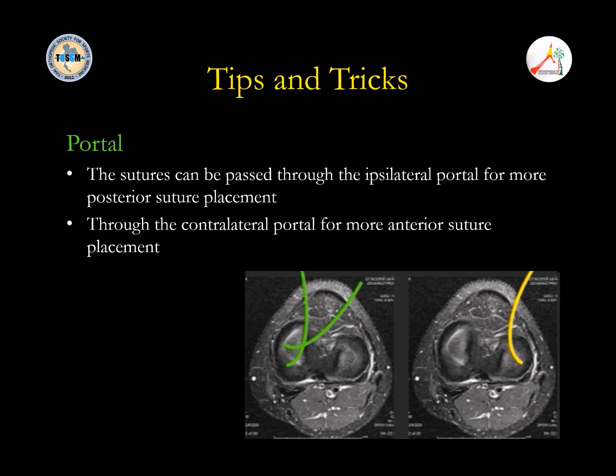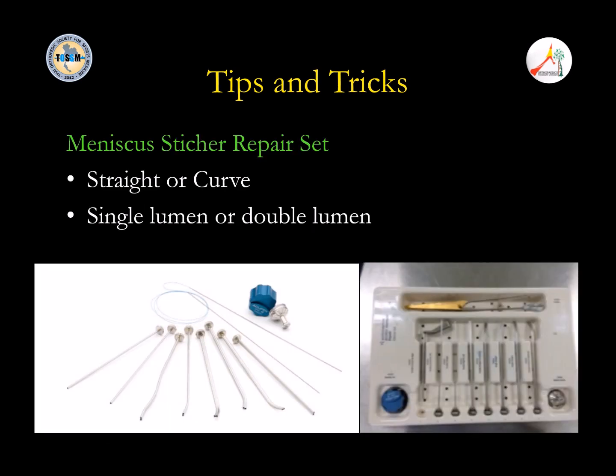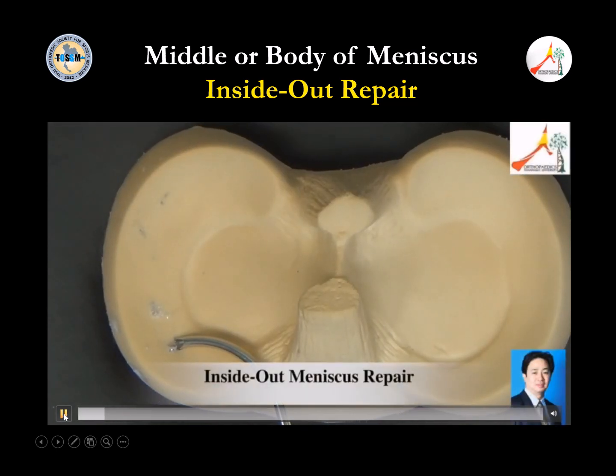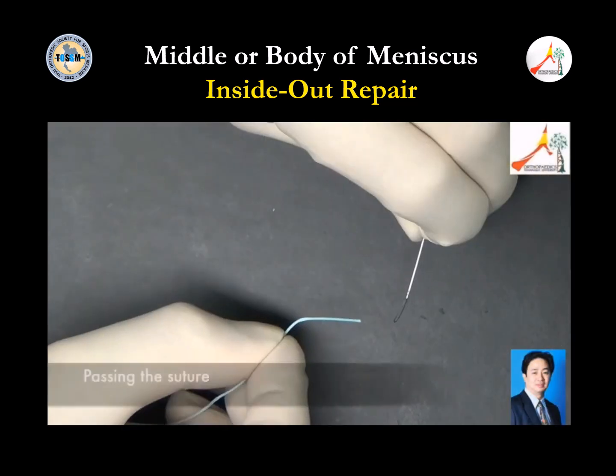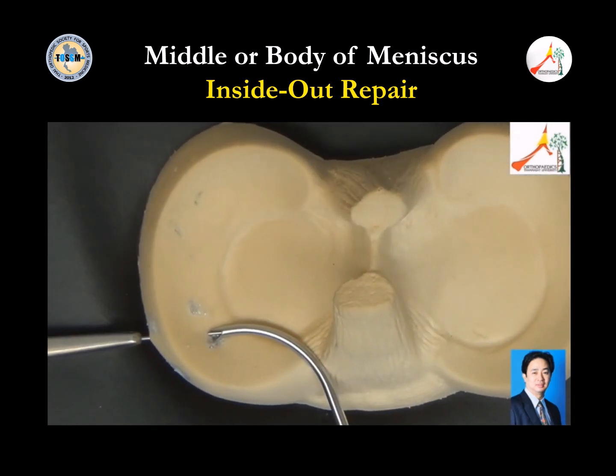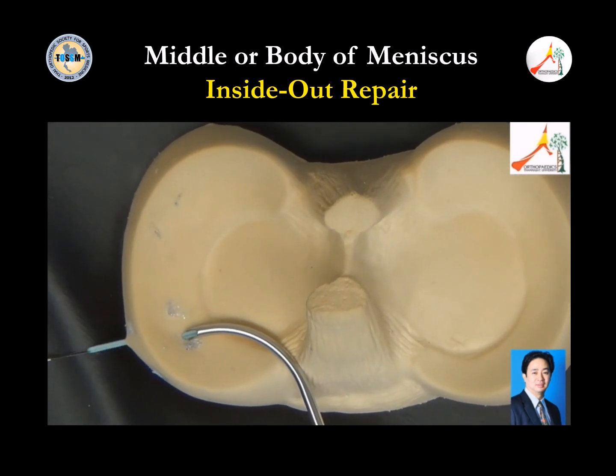In inside-out, if you want to repair this side, your camera must be on the same side, and your instrument comes from the lateral, from the opposite side. Smith & Nephew have the meniscus stitcher repair set. They have straight and curved, and it's also bendable. There is a single lumen and also a double lumen. You can use it and we can see in the lab. I will show you one demonstration. This is the inside-out. If you want to repair this side, you can come from the opposite side. And very important, you need to protect the needle.